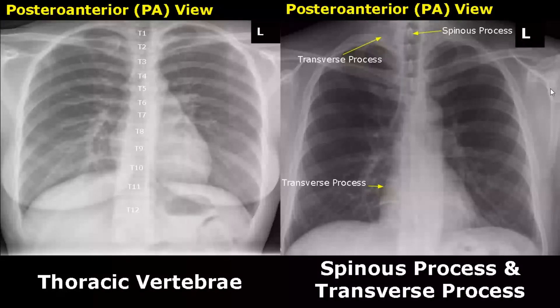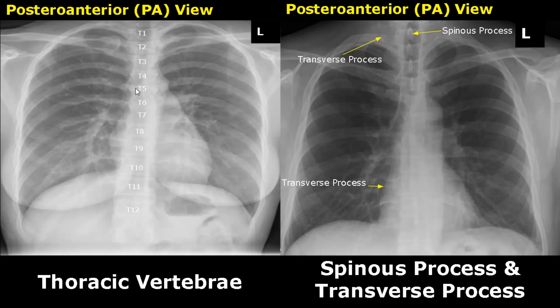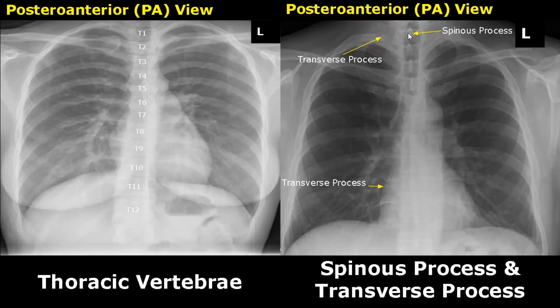We can also see the thoracic vertebrae and their parts. Here are all of the 12th thoracic vertebrae; they are barely seen behind the heart. Here we can see the 12th thoracic rib coming off the 12th thoracic vertebra. The spinous process can be seen at the center of the vertebra with a vertical orientation. We can also see the transverse process right next to the vertebral body and slightly below the rib.